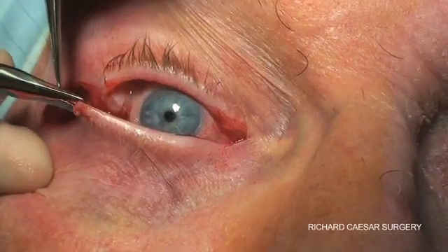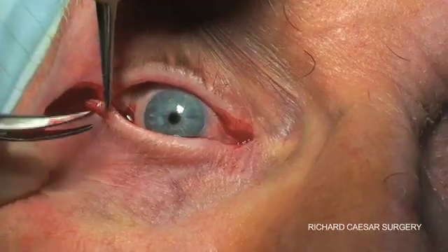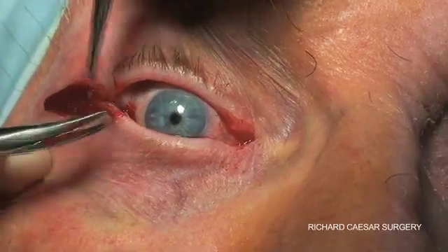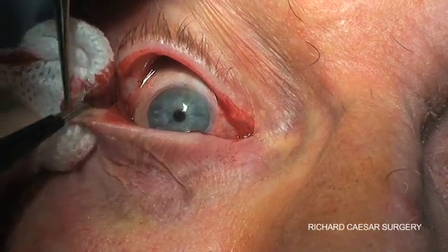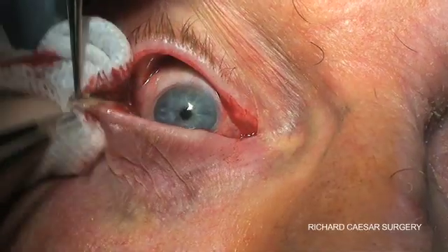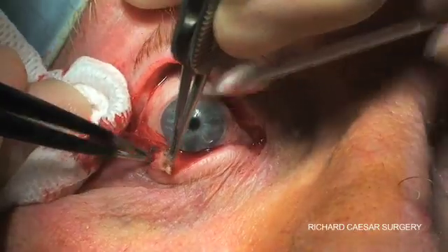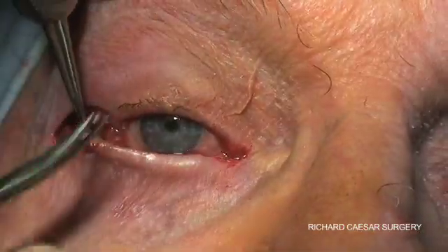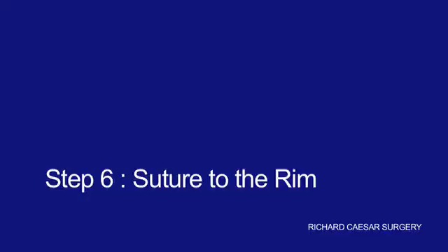You've cleared the tarsal plate of the orbicularis. Then you trim off the upper edge so the lid margin is removed. I use cautery to remove the conjunctival layer, and the heat of the cautery can also empty the meibomian secretions. Finally, I snip off the end I'm holding as this is often not fully cauterised, and the tarsal strip is then created.